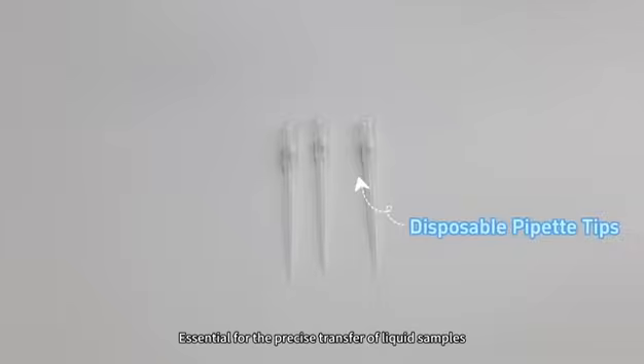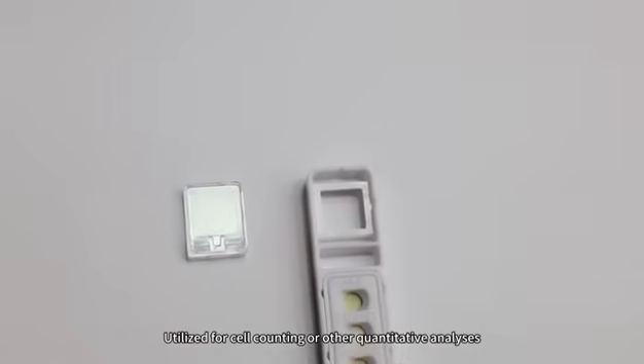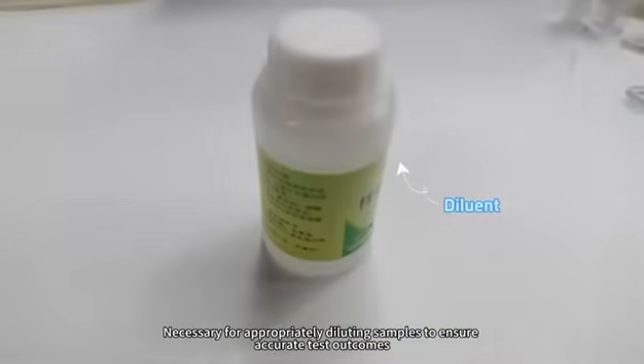Disposable Pipette Tips: essential for the precise transfer of liquid samples, minimizing the risk of contamination. Disposable Counting Chambers: utilized for cell counting or other quantitative analysis. Diluent: necessary for appropriately diluting samples to ensure accurate test outcomes.